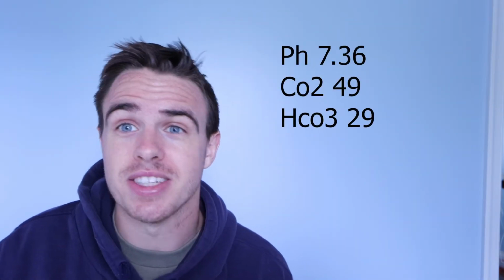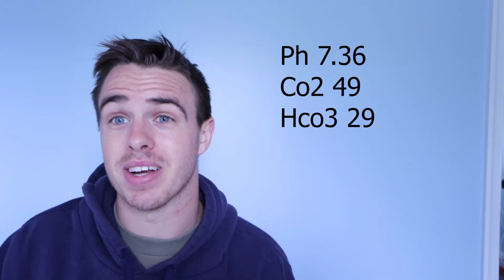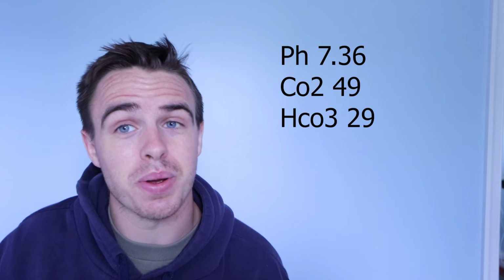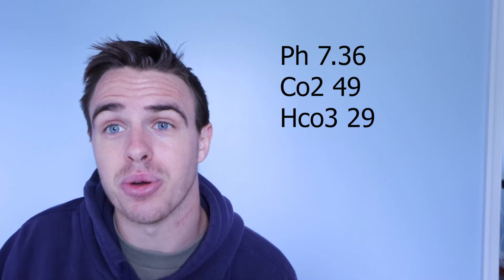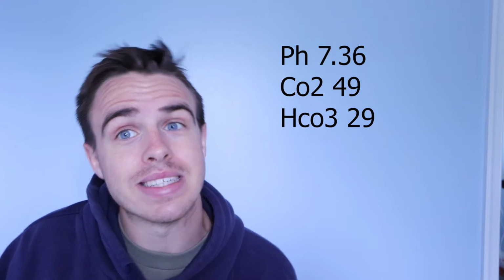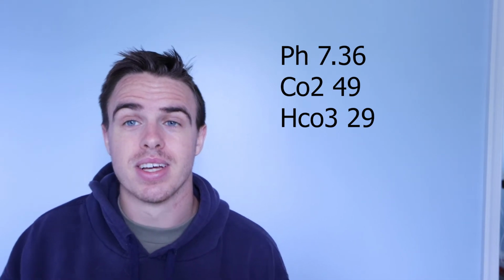Now this gets a little bit more complicated. Remember I told you to always look at the pH first? Well, look at this one here. We can see the pH is in normal range, so this must be a normal ABG, right? Wrong, because we want to look at everything else that's going on as well. So we look at the CO2 and it's not normal range. Look at the bicarb, and it's not normal range either. So what the heck is going on?